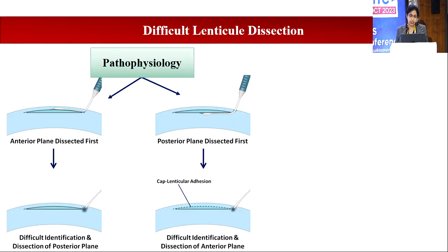Difficult lenticule dissection is the second challenge. With the laser, you have suction loss, then the lenticule dissection. Either you dissect the anterior plane first as is described, and you have difficulty identifying the posterior plane just by virtue of maybe inexperience, maybe a difficult anatomy.